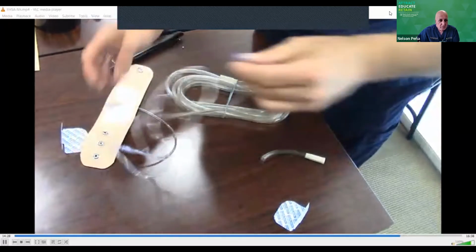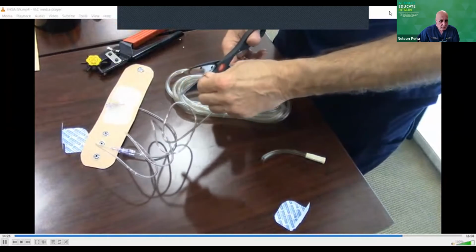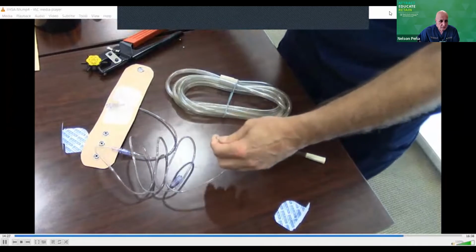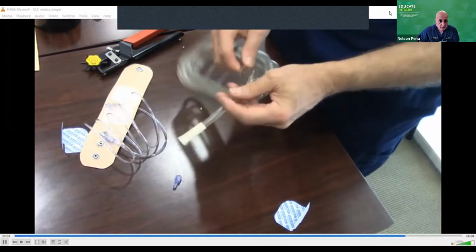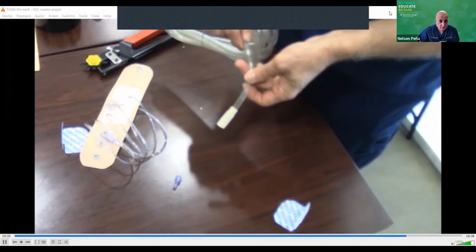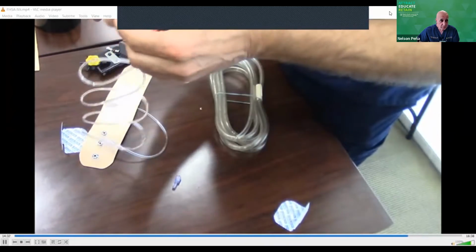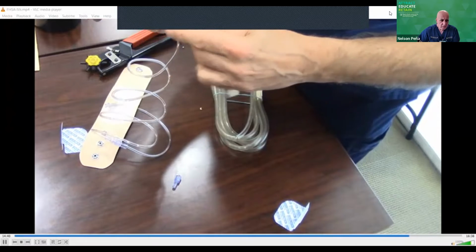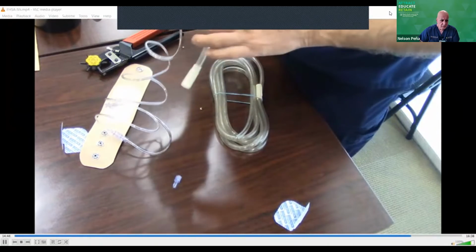the rest of the tubing to the thing, we need to cut this tip off because there's no way you're going to be able to get that luer lock attached. Now with this piece of suction connecting tubing, you just cut yourself off a little piece like that. And what you're going to do is insert the tubing all the way nice and deep inside so that the tip is all the way over here.